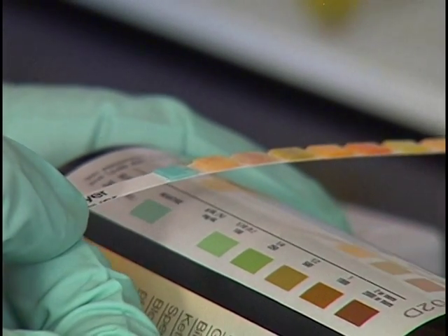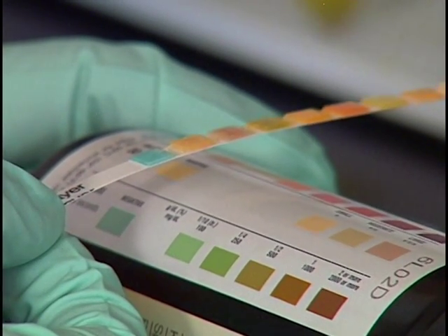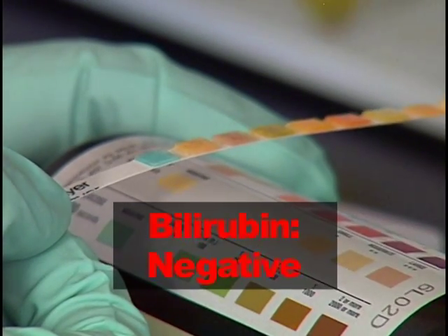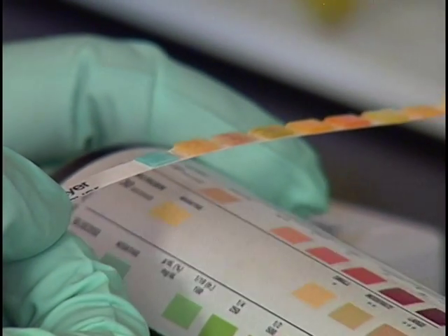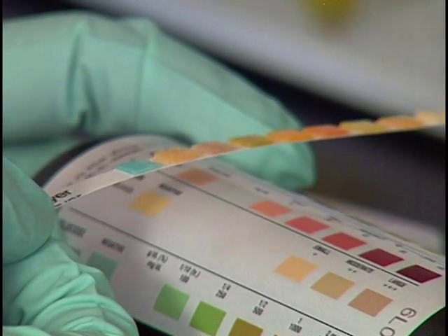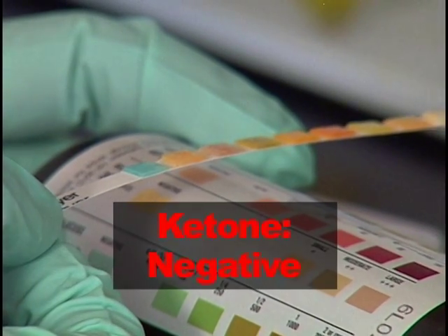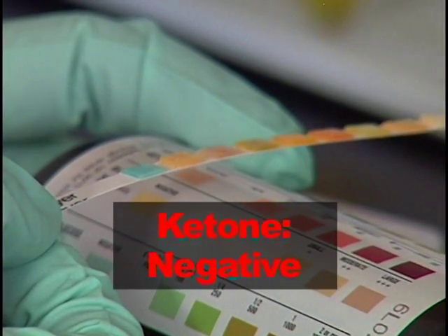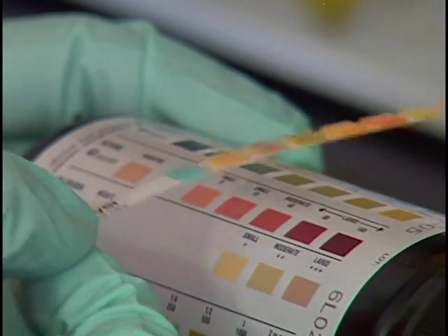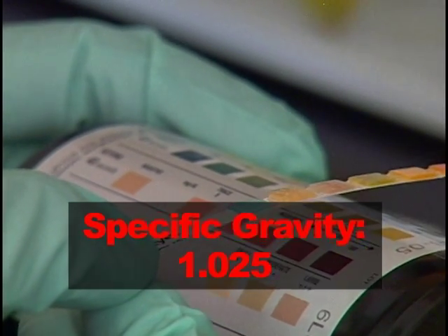Bilirubin is also read at 30 seconds. Carefully match the color of the bilirubin reagent block with its corresponding color on the color chart. The result for bilirubin is negative. Continue reading the test results at the specified times. The ketone result is read at 40 seconds. The result for ketone is negative. Specific gravity is read at 45 seconds. The result for specific gravity is 1.025.